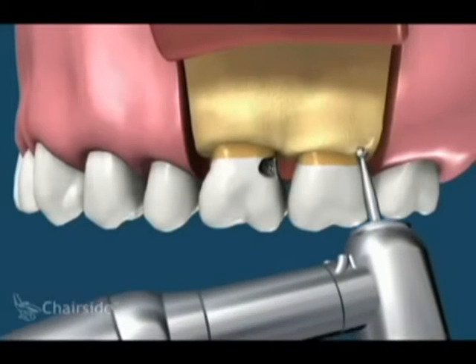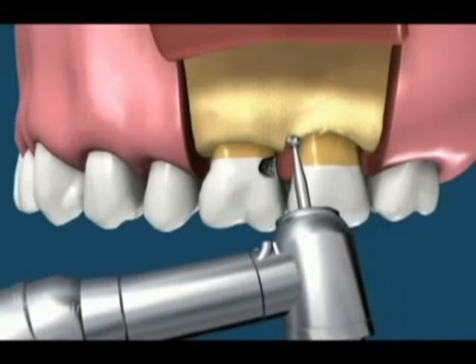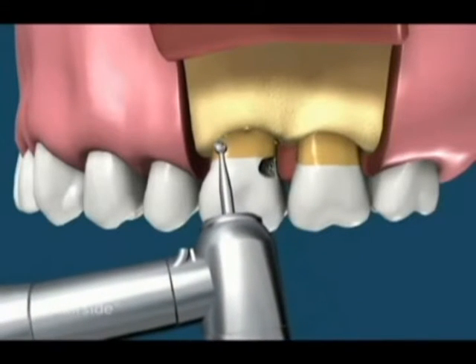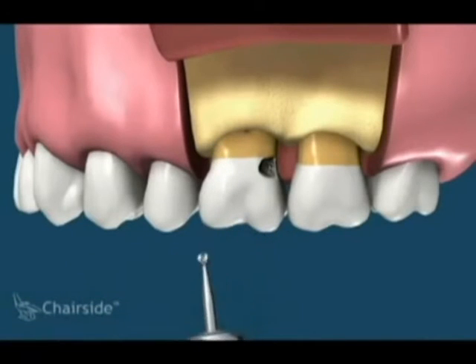Different instruments, including the dentist's drill, are used to reduce the bone height, and this new bone architecture is prepared to support the gums in a lower position on the root of the tooth. The new bone topography must follow all the previous peaks and valleys.